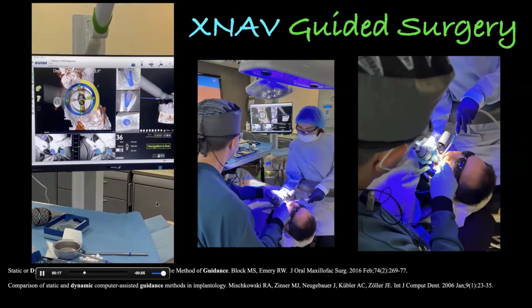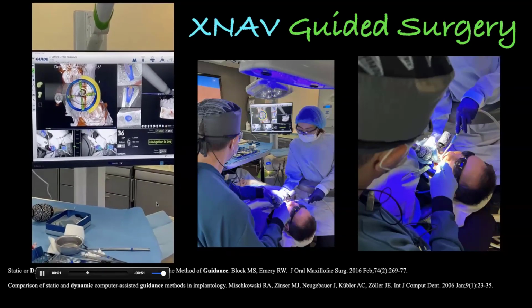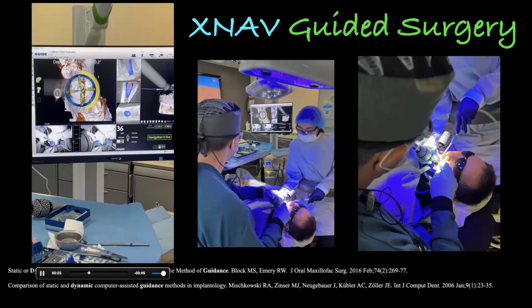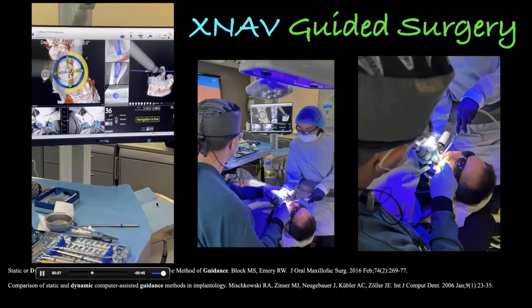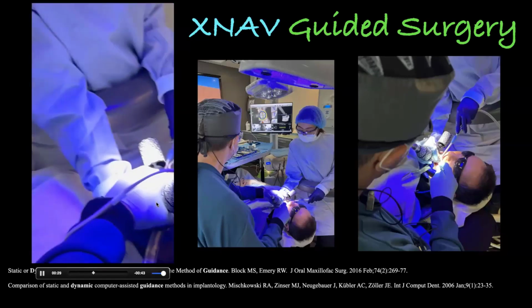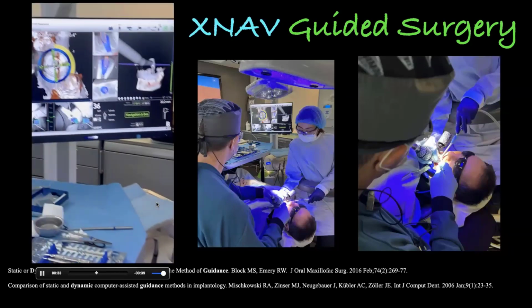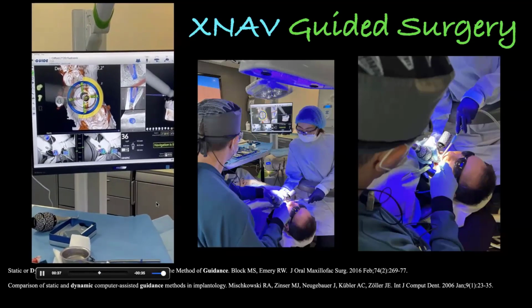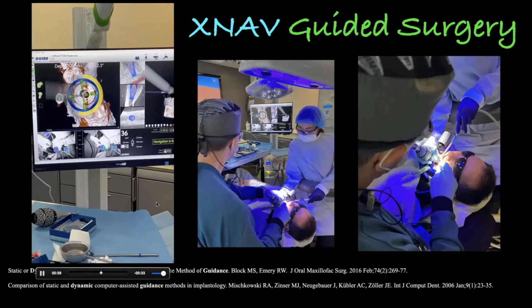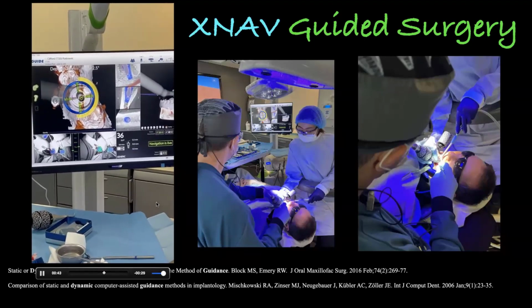This surgery is done by Dr. Chris Long, who's one of my business partners, who's the number one user of XNav in Canada. And at all times he's looking at the screen, playing what I would call target practice while you're drilling on someone. You have these fiducial markers that help the camera locate where the CBCT and where the drills are at all times. And that really allows you to do a really good job and really plan where things are, and really to get a great result.